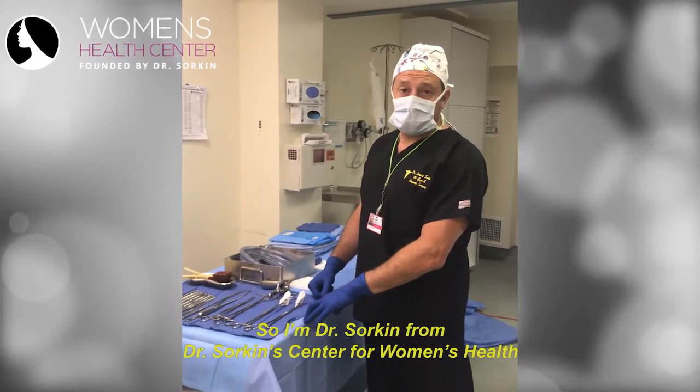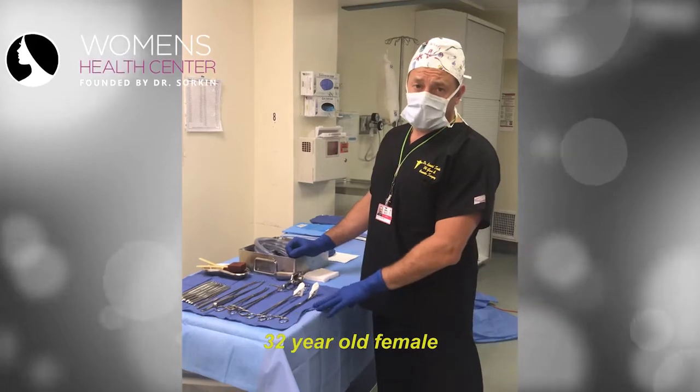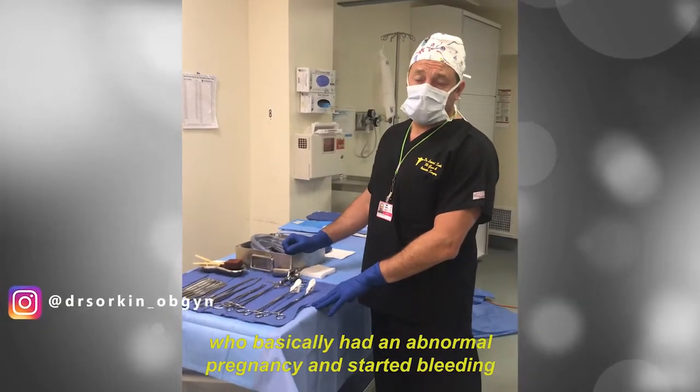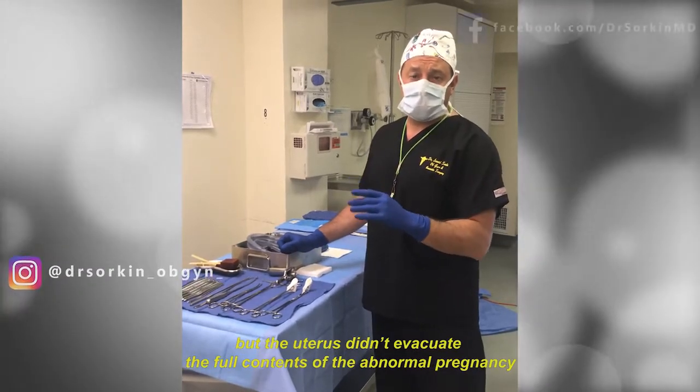I'm Dr. Sorkin from Dr. Sorkin Center for Women's Health. Today I'm going to be doing a D&C on a 32-year-old female who had an abnormal pregnancy and started bleeding, but the uterus didn't evacuate the full contents of the abnormal pregnancy.